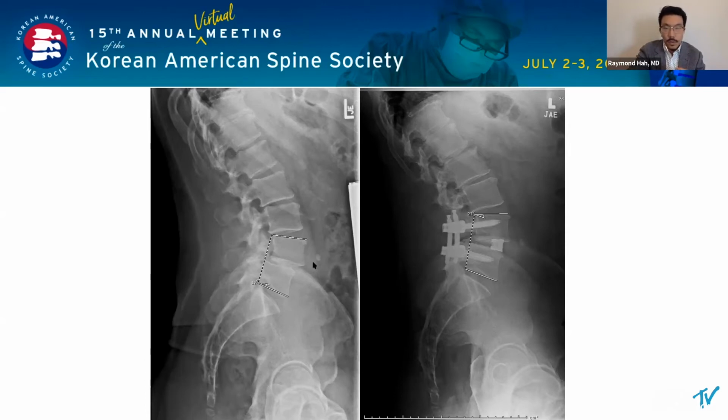I think this was a little earlier in my practice. I would have treated this differently now. I would have perhaps done a little bit of a pseudo ALL release with an X-lift technique, and then cut the facets and tried to get a little more. You can see in his postoperative course, he is now compensating with hyperextension more.